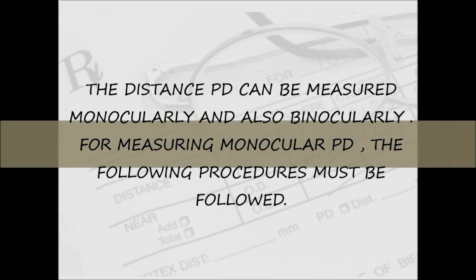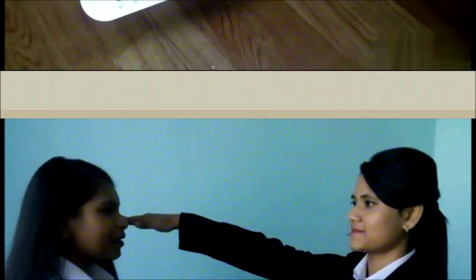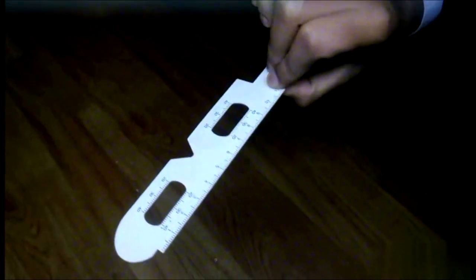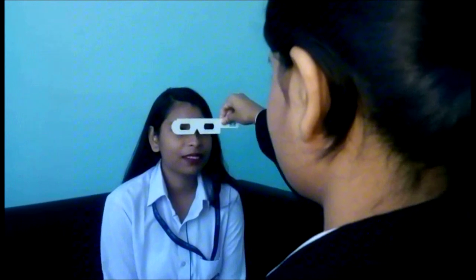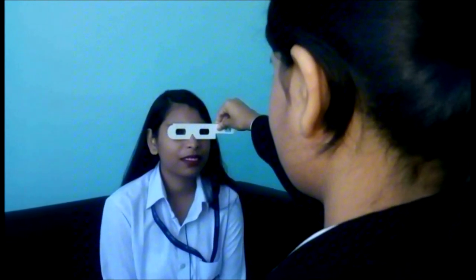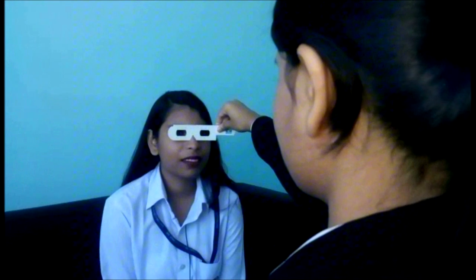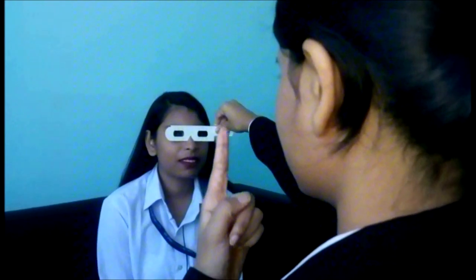For measuring monocular pupillary distance, the following procedures must be followed. The examiner and patient sit opposite each other at arm's length. The examiner holds the PD ruler between their thumb and forefinger, resting the ruler at zero on the bridge of the patient's nose, and steadies their hands by placing their remaining fingers against the patient's head.